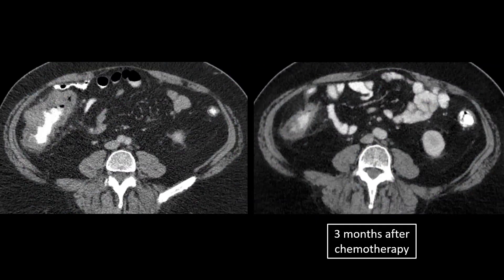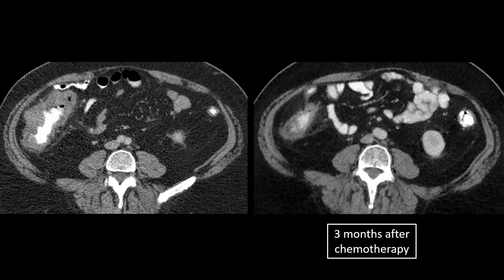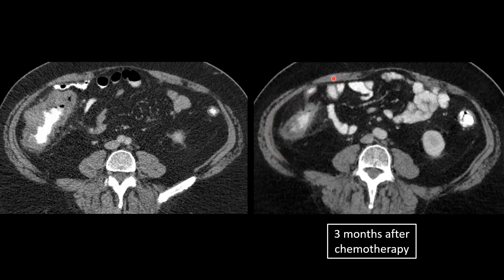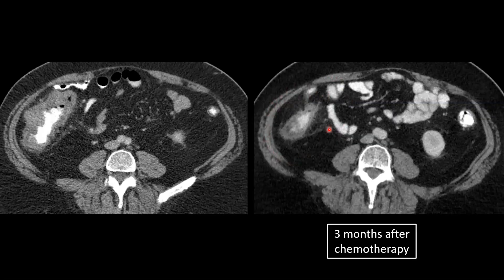Why is it important to differentiate large bowel lymphoma from colonic adenocarcinoma? Adenocarcinoma is typically treated surgically, whereas lymphoma is extremely chemoresponsive. As you can see here, this is the same patient three months after chemotherapy — there's marked reduction in tumor.